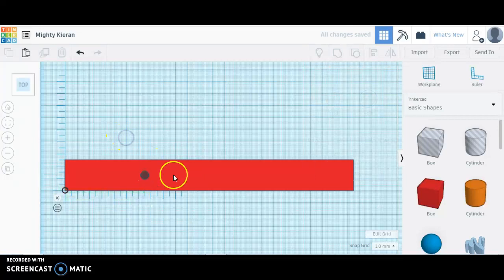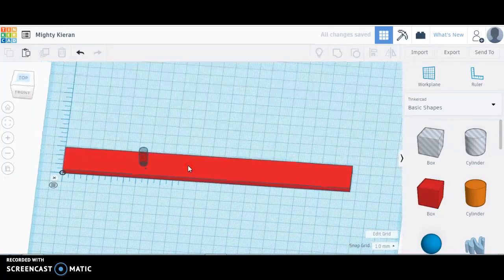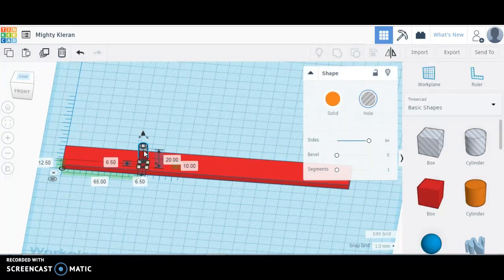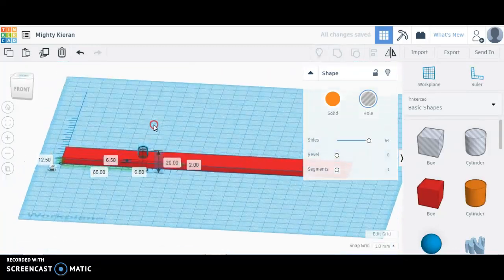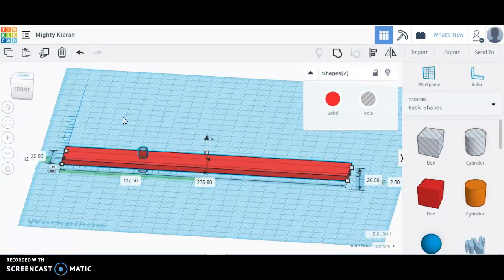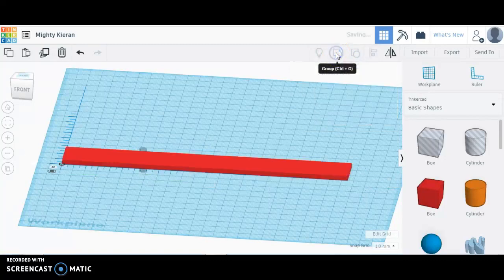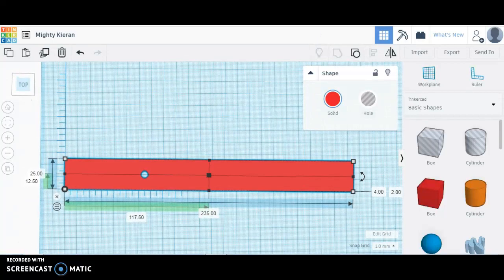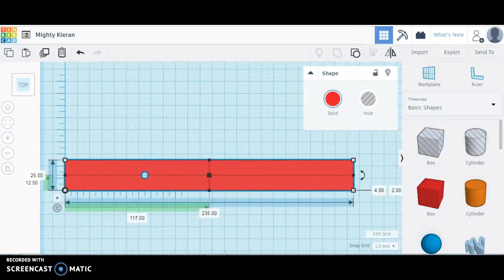Okay, that hole is properly positioned, I believe, and it should be flat on the plane, ready to cut a hole right through that rectangle. It can also be moved, not that that's necessary in this case. But I just need to select both items by dragging them in a box, or I could use Control A, and I can group them right here. Note that the shortcut is Control G. I usually like to use the keyboard, but since I'm making a video, I'll show clicking on that button. Okay, so that hole is placed.